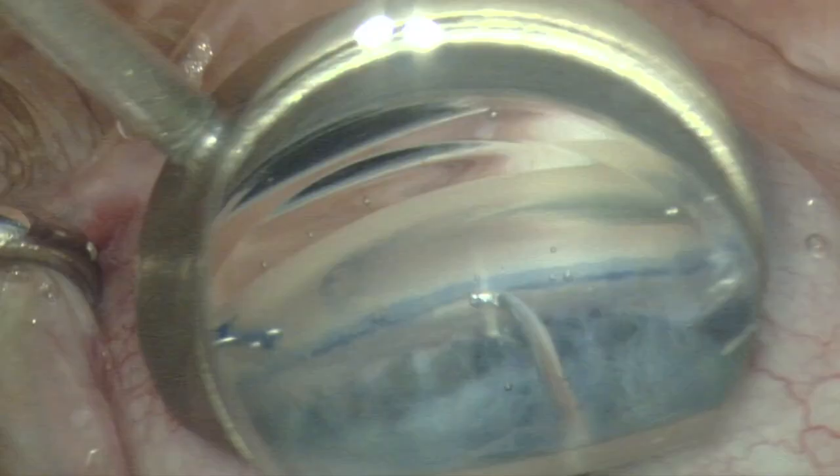This is an example of a canaloplasty combined with cataract surgery by Dr. Mary Keel. A paracentesis has already been made. Lidocaine was injected into the AC, and trypan was used to stain the anterior capsule and the trabecular meshwork. The AC has been filled with Healon 5, and a main wound has been made.